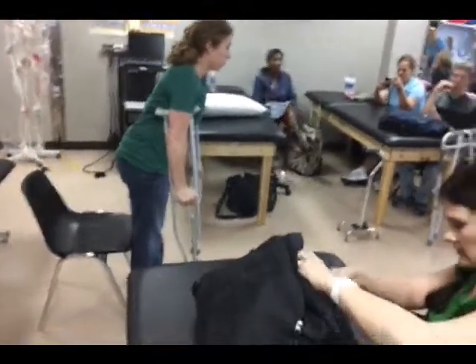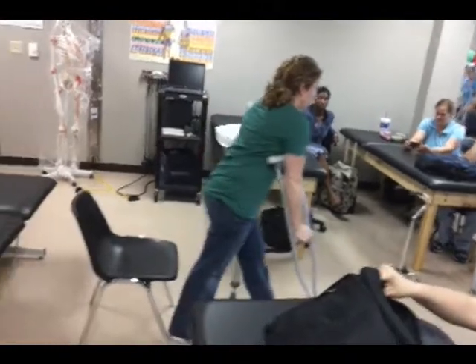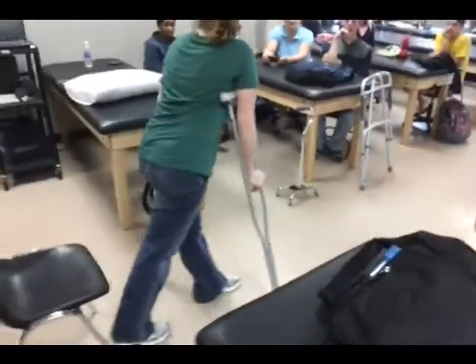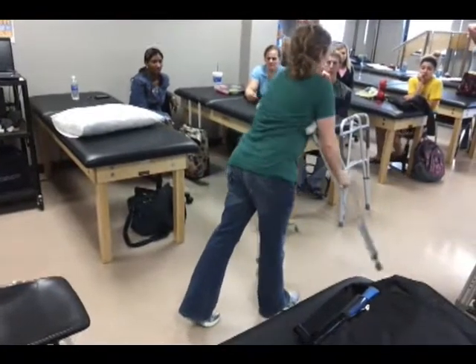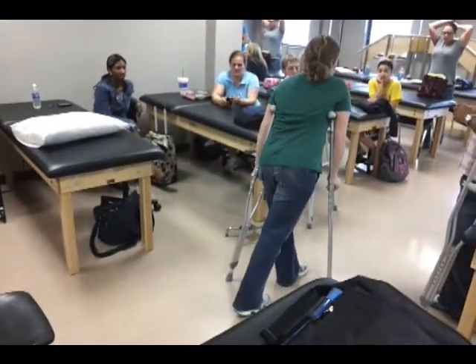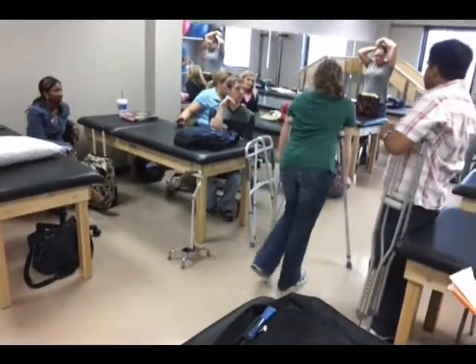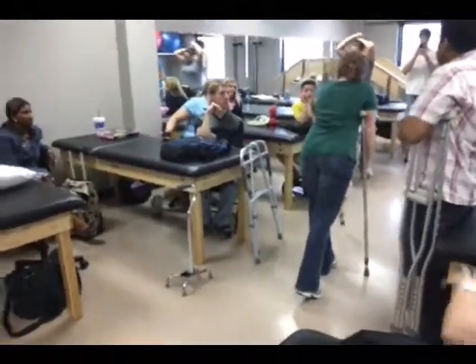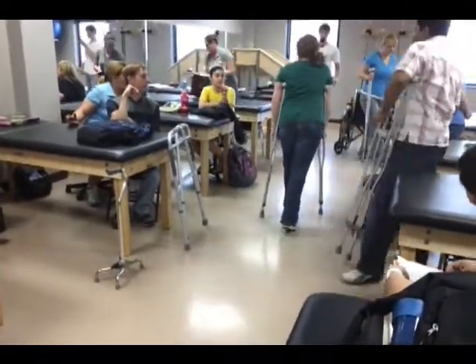I advance a crutch and the opposite foot, crutch and the opposite foot. What is this again? 4-point. It's my slowest, most steady with 2 assistive devices. 4-point. Opposite, opposite, opposite, opposite.